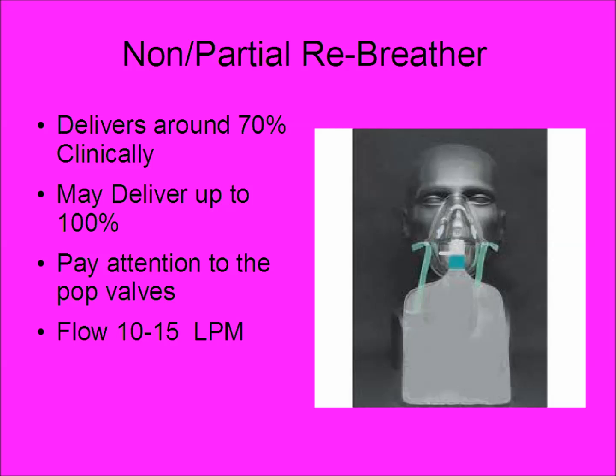The next device is the non or partial rebreather mask, and I say it's non or partial rebreather because you can make either one of these masks either a non-rebreather or a partial rebreather simply by taking those exhalation valves on either side of the nose off or on. If you have them on, then it is a non-rebreather, and with them off, it's just a partial rebreather.